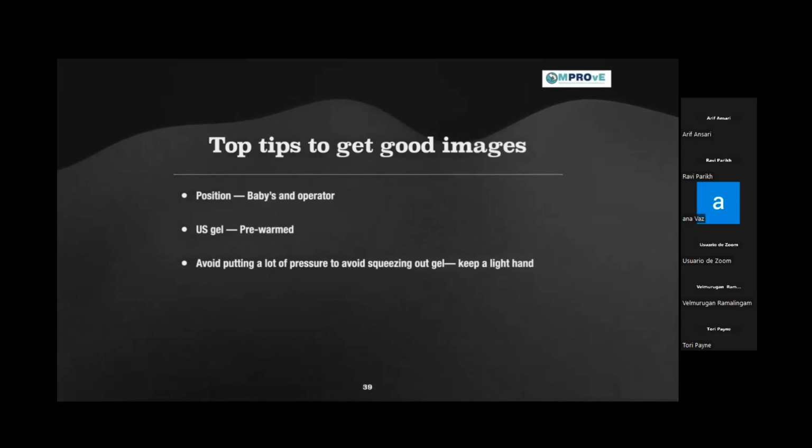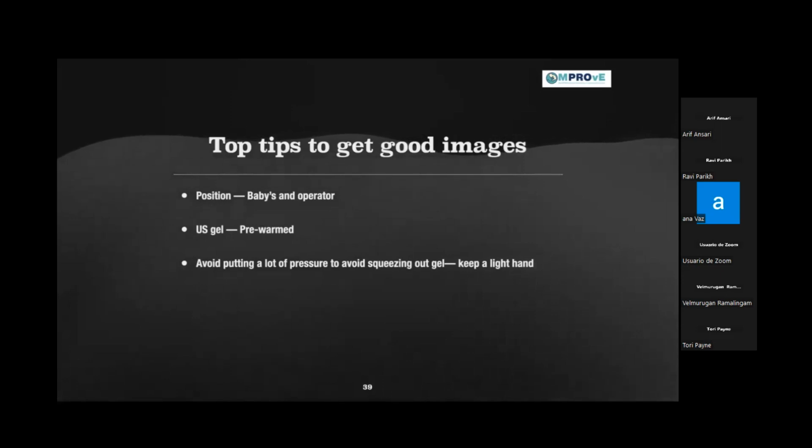As you can imagine, if the baby has been put supine for 1 hour on CPAP and you come to scan, by virtue of gravity whatever fluid was in the lung has gravitated towards the basal portion, which would be the back of the lung if the baby is supine. It will be role reversal when the baby has been put in a prone position; the fluid will gravitate more towards the front of the chest.